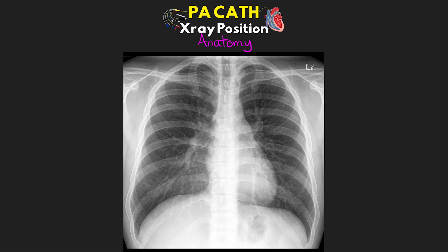First let's talk about our airways. We want to identify the trachea, which is the large descending portion. Next, from the trachea, we have the branches to the right main stem and the left main stem. Where these branch, this is where we can identify the carina. The right main stem is short and more vertical, while the left main stem has a longer, more horizontal path.